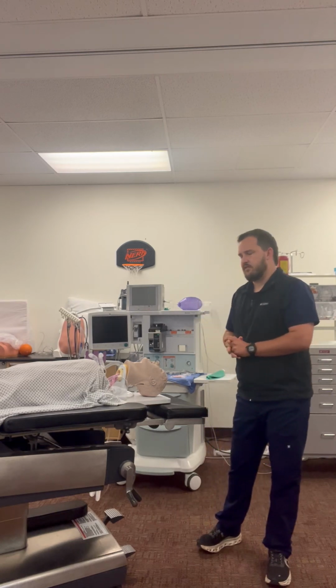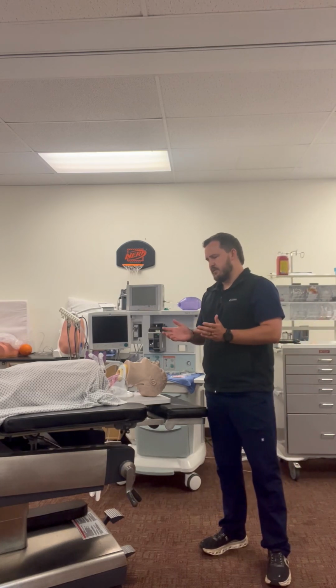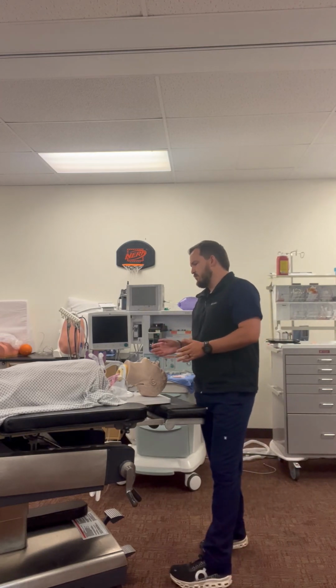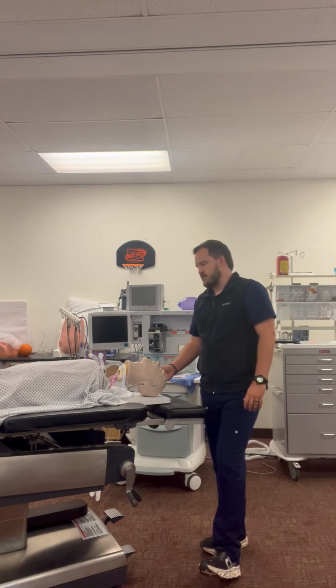And then I'm going to confirm that he's been NPO, make sure he hasn't eaten or drank anything within the last 6 hours for food or 2 hours for liquid. Then I'm going to go over the anesthetic plan with the parents. I'm going to discuss that I'm going to bring him back. We're going to lay him onto the bed. We're going to make sure he's comfortable and warm, and then I'm going to put a mask on, give him some gas to make him fall asleep.